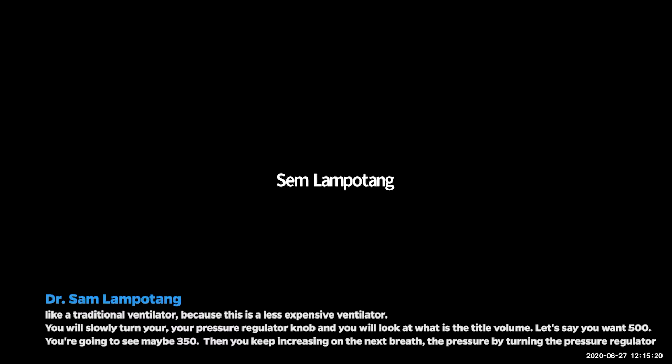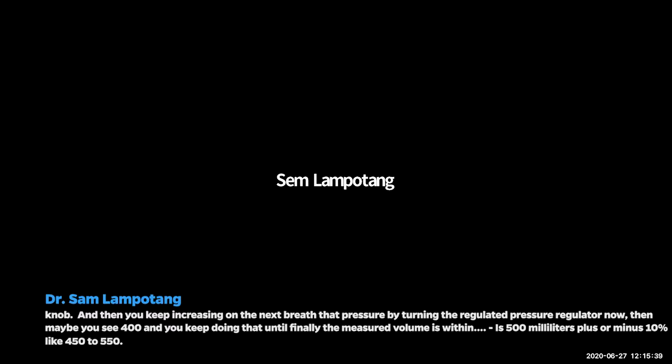You will slowly turn your pressure regulator knob and you will look at what is the tidal volume. Let's say you want 500, you're going to see maybe 350. Then you keep increasing on the next breath the pressure by turning the pressure regulator knob. Then maybe you see 400, and you keep doing that until finally the measured volume is 500 milliliters plus or minus 10%. So like 450 to 550.